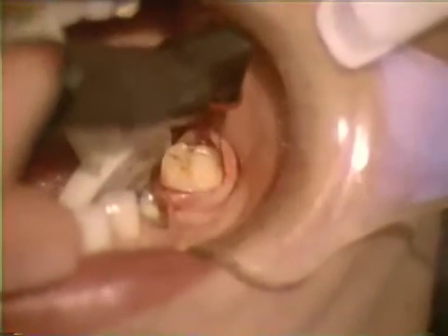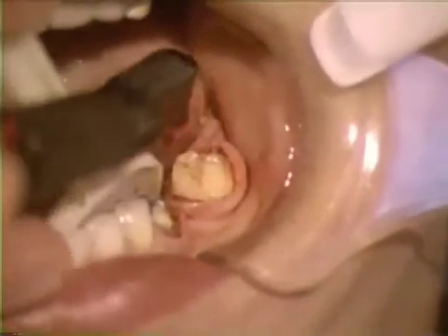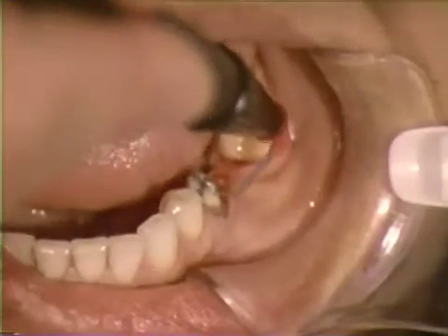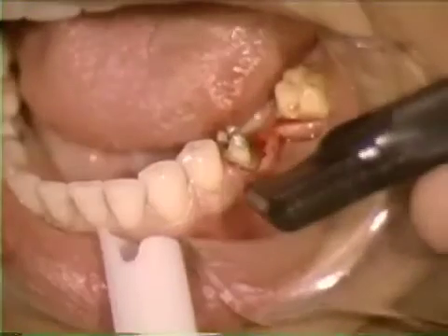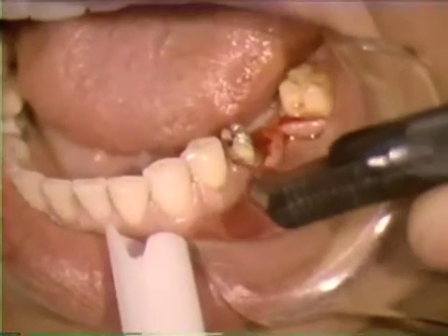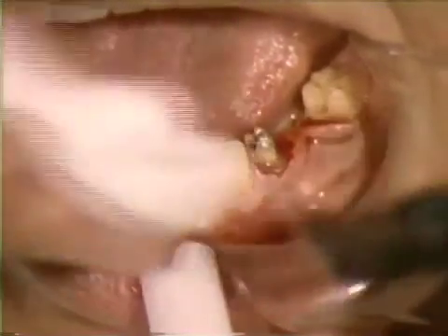Electrosurgical procedures provide the clinician with a convenient way to remove undesirable soft tissue. It must be emphasized that electrosurgery should be used for removal of soft tissue only and not for osseous surgery. The purpose of this program is to discuss the basic principles of the electrosurgical unit and technique and demonstrate applications of electrosurgery in restorative dentistry.